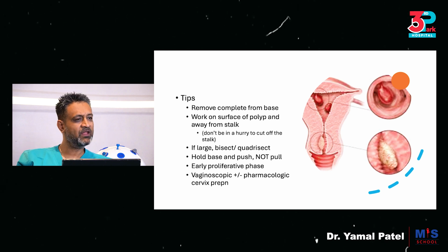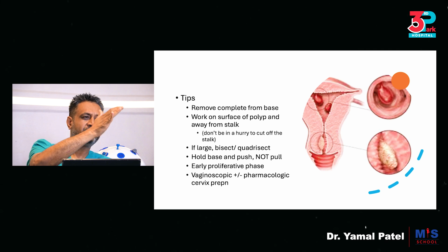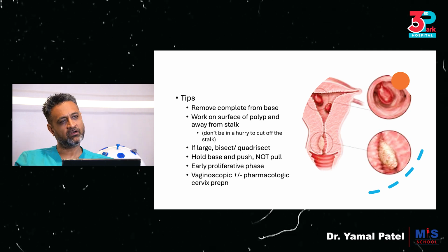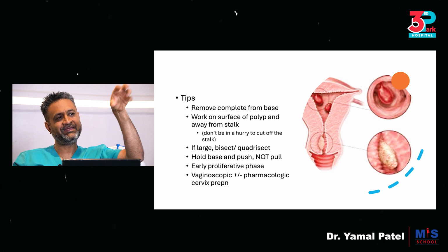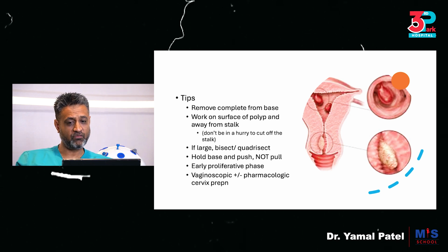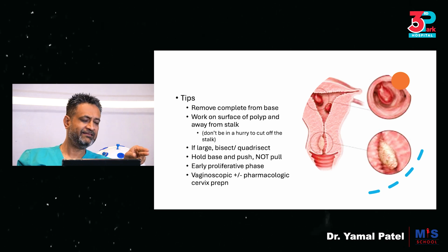When it's a large polyp, work on the surface of the polyp and away from the stalk, going towards the stalk. Don't be in a hurry to cut off the stalk. You'll have a polyp floating in there. They'll be very difficult to now capture and remove. If it is small, you can work from the base.